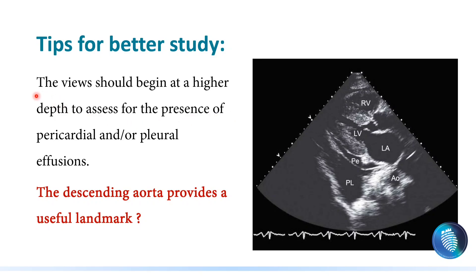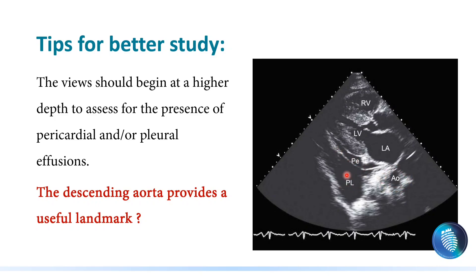The first tip is that we should begin at a higher depth to assess the presence of pericardial or pleural effusion. Note that both may coexist together, and we will miss this if we don't increase the depth. As discussed in the previous lecture about how to adjust the depth, the descending aorta provides a useful landmark to differentiate between pericardial effusion and pleural effusion.